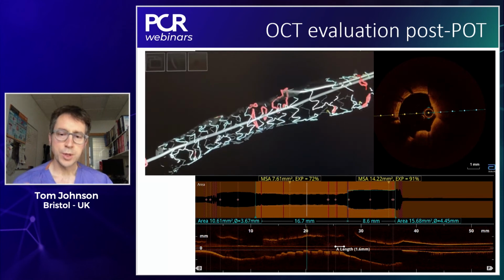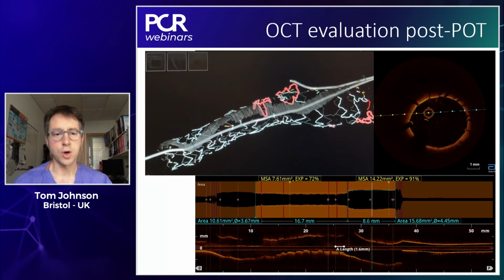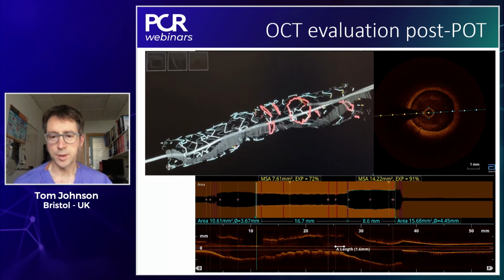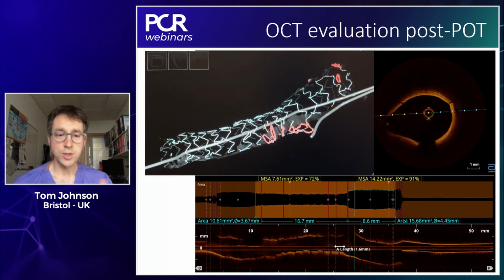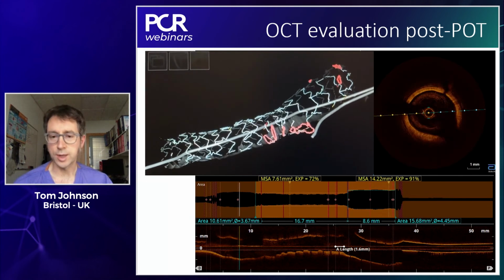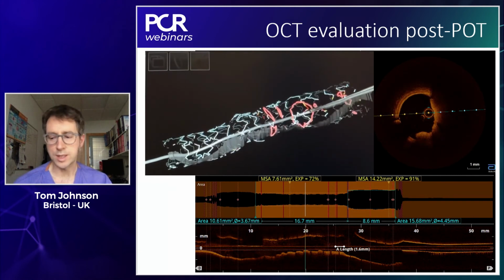And so at this point, as Javier said, this isn't like treating a diseased left main. This is about now trying to optimize for the long term in this 49-year-old gentleman. And so now I want to recross and try to cover those struts, and then sequentially post-dilate the LAD stent to ensure that we get optimal expansion, certainly above 80%, if not above 90% if I can achieve it.